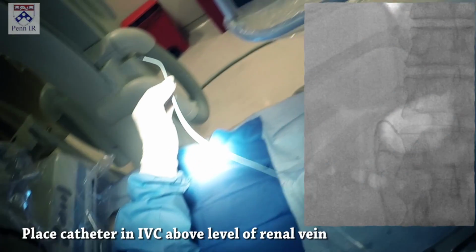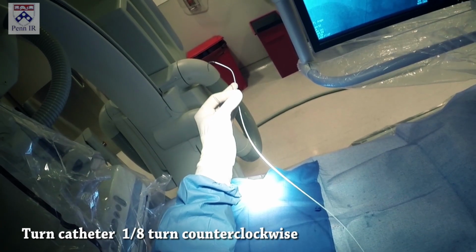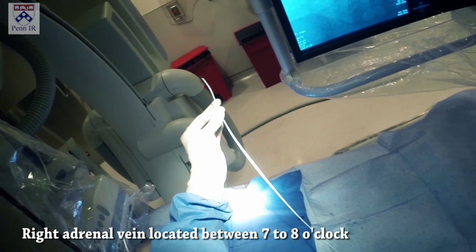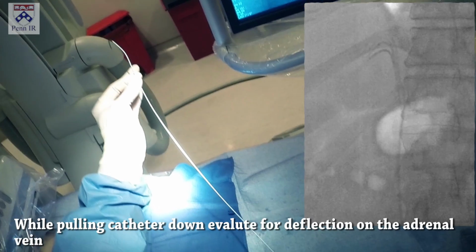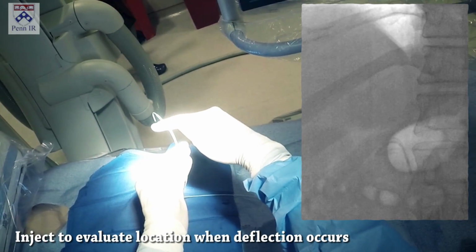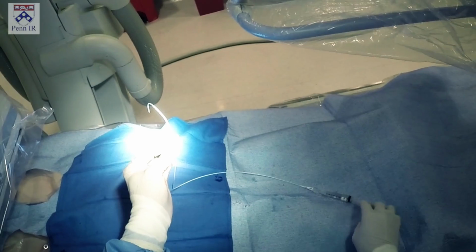I pass this catheter up into the inferior vena cava, above the level of the renal vein, and then I'm going to turn it posterolaterally, just like that, because the adrenal veins come off between 7 and 8 o'clock if you're looking at it like a clock face. We pull that down and look for any deflection of the catheter as it comes down. If we see it hang up like that, that's when we inject. So we don't go down injecting, we only inject when we see that deflection.